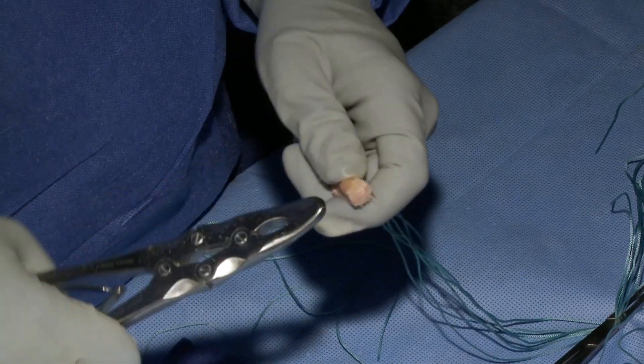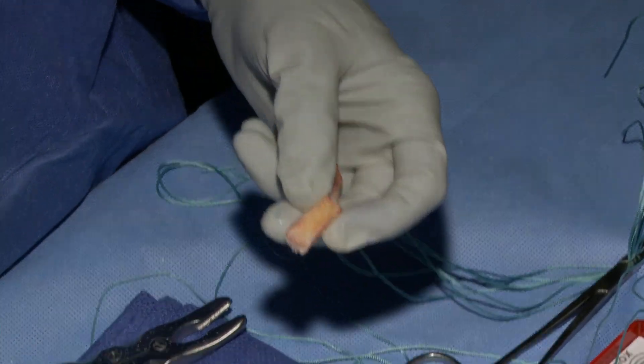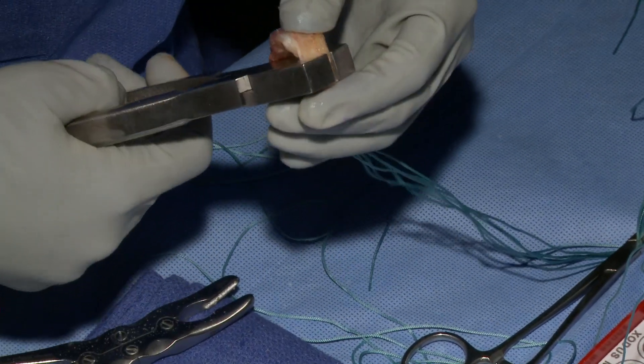Next I start the femoral bone plug, which is harvested from the tibia. The orientation of the graft is flipped upside down from the way that it was harvested.